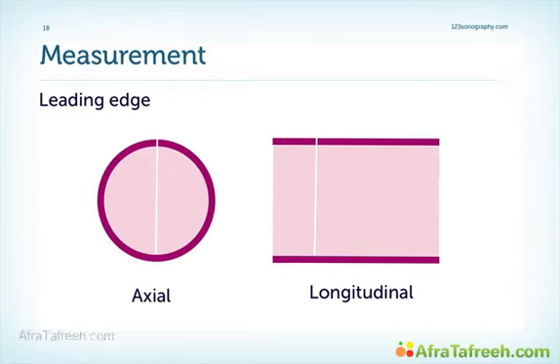As always in echocardiography, we should use the so-called leading edge technique. This means we measure the front of the aorta, the lumen, and then the front of the posterior contour of the aorta. So we're only measuring the wall once. Even though the wall of the aorta is fairly thin, and it probably does not make much of a difference, I would recommend you to use this technique.